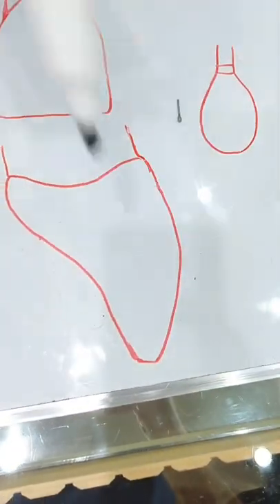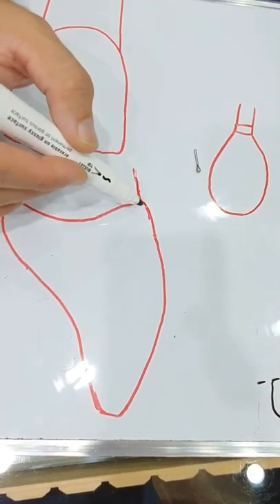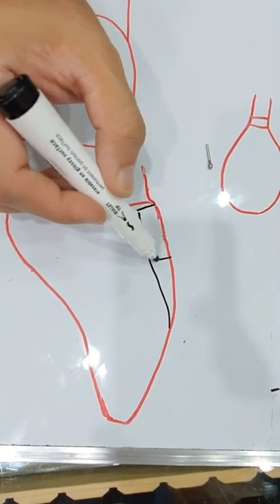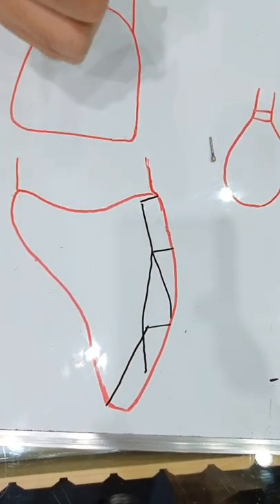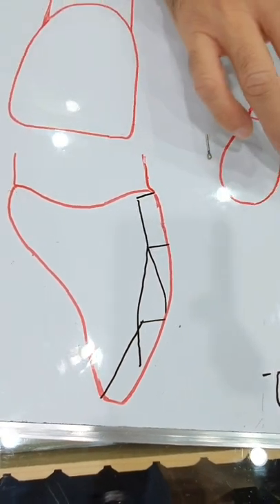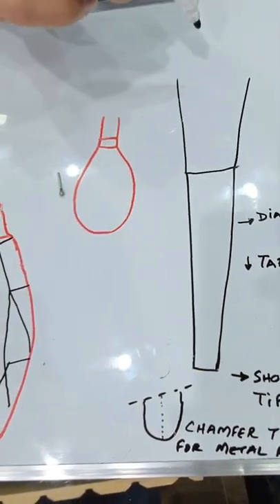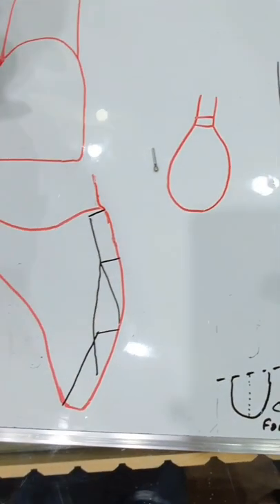So I'm going to erase that now. In order to do the prep of an incisor or a canine, you would have to have multiple surfaces on the facial. So this is where the margin is being started. The first facet would be right here. Then the second aspect would be right there. And the third aspect would be right here. So it has to be prepped in 3 aspects. And again, the best burr would be just like the posterior burr that we were using, a straight tip or a shoulder tip, chamfer burr with converging walls as it goes towards the tip. That would give you the right convergence when it comes to prep interproximally.